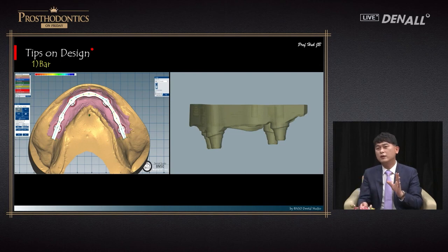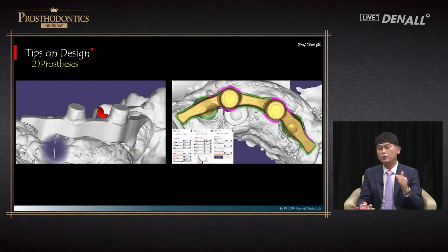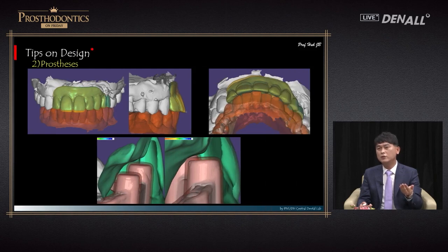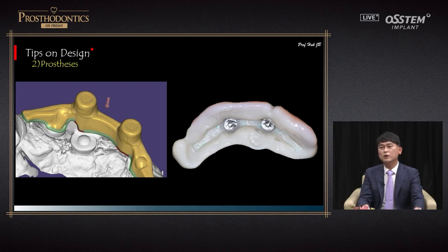As we design using software, screw holes can be made fitting the path, and spaces can be controlled as we want. So designing is all done in software. If you create a zirconia prosthesis, the prosthesis itself can be made with the proper gaps. Because of that, I can use the zirconia removable prosthesis in front of you today. Digital development enables the use of materials, and when it is combined with the software, it is creating a new area in dentistry. I'll show you a case later.